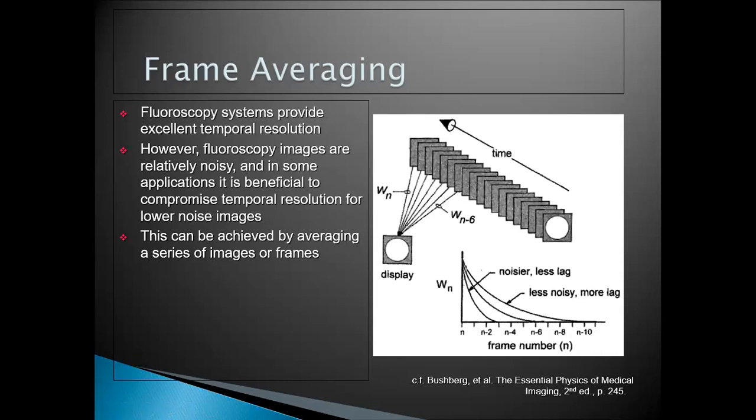By doing that, we have reduced the noise. The image we are going to get at the end of the day will have reduced noise. So this is the average of all these images that have been captured. At the end of the day, this is going to have a better SNR, signal to noise ratio.